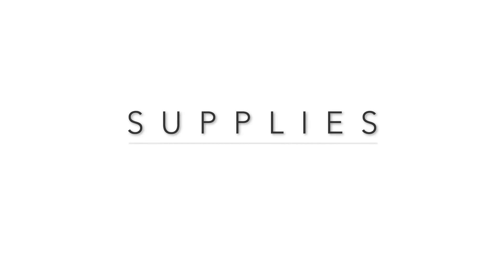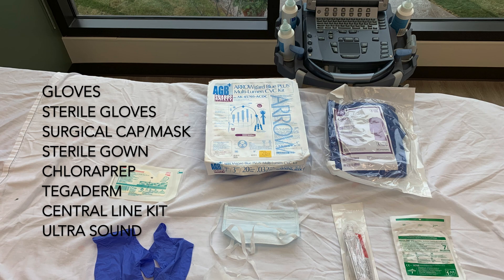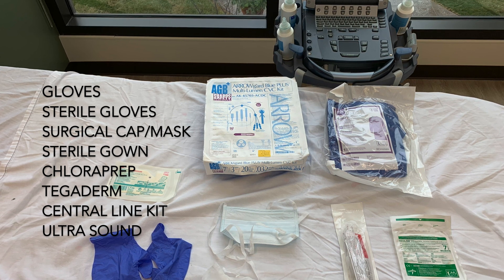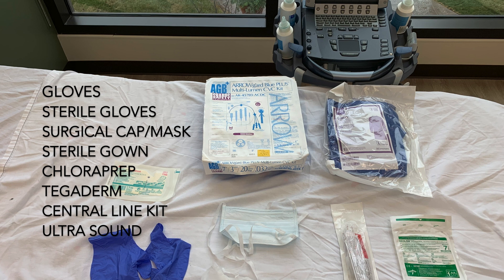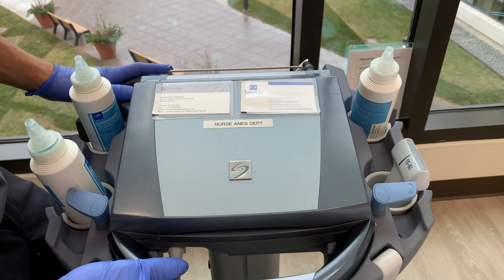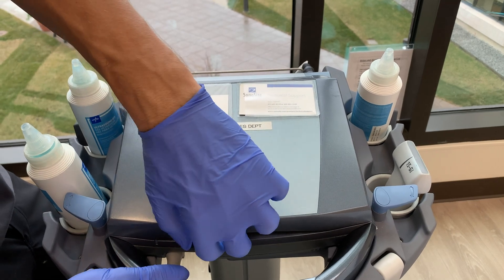The following supplies are needed for this procedure: gloves, sterile gloves, surgical cap and mask, sterile gown, chloroprep, tegaderm, central line kit, and ultrasound machine. After gathering the appropriate equipment, place the ultrasound machine on the opposite side of the patient and turn it on for use.